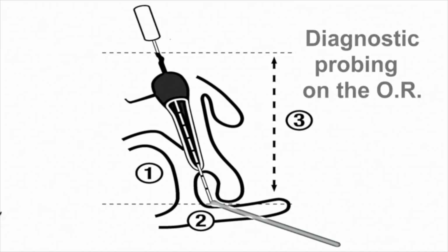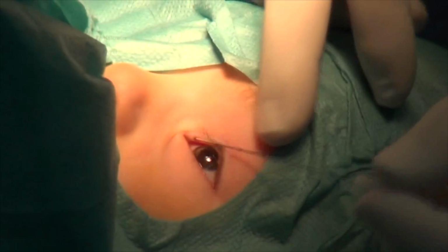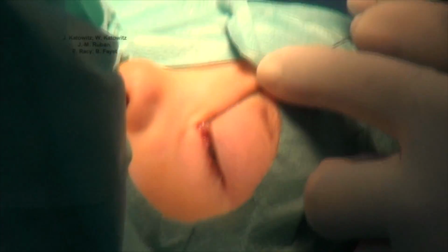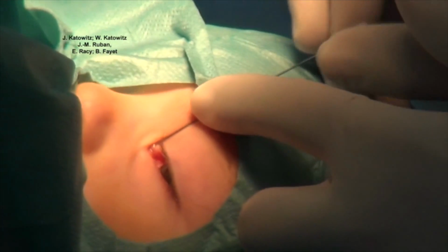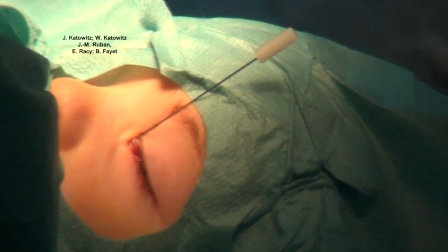The diagnostic probing on the operating table must answer three questions. First, what is the type of nasolacrimal stenosis or obstruction? Tactile sensations will differ depending on the location and severity of the nasolacrimal problem. Simple mucosal stenosis is by far the most frequent kind, and the probe will usually pass easily through an obstruction at the valve of Hasner. Complex stenoses, however, are more difficult to pass through, and a false passage can too easily be created.